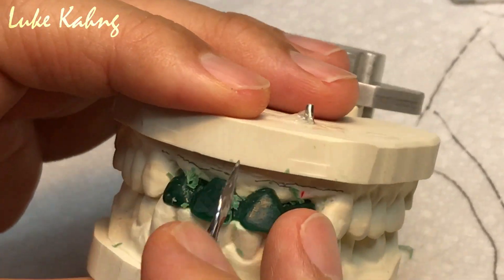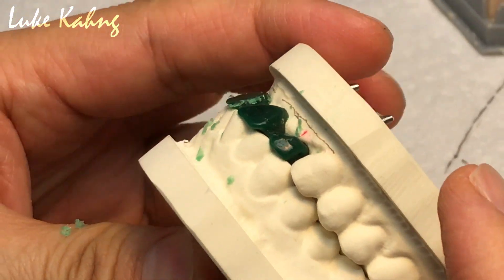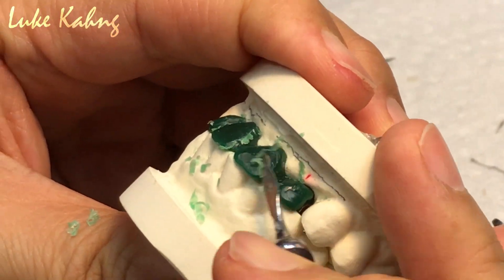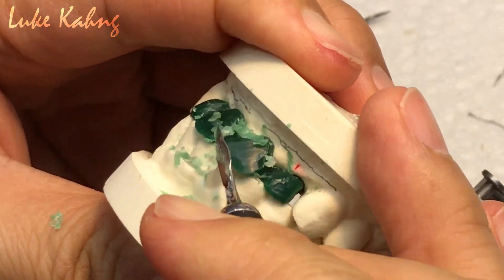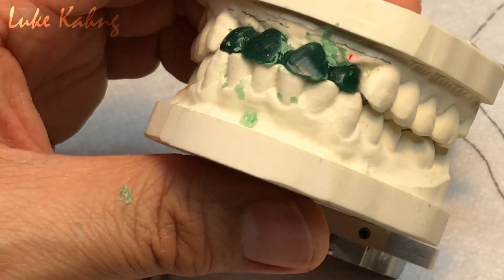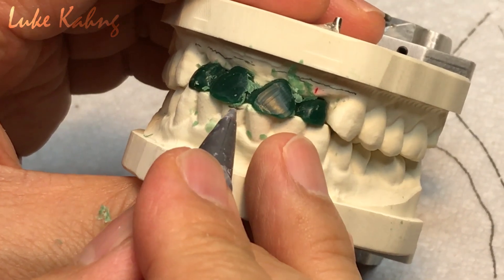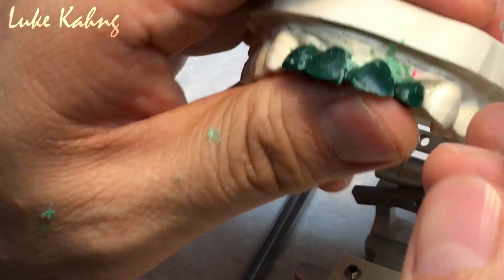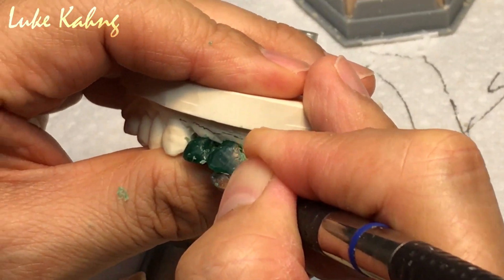I have to move to this. So whenever I cut it, same thing — I have the same thickness. Why? Because it's a pontic. Too thick. So I cut it. And little tricky part. Here will be finer. That's finer. Too long. So I cut it — just a little bit.